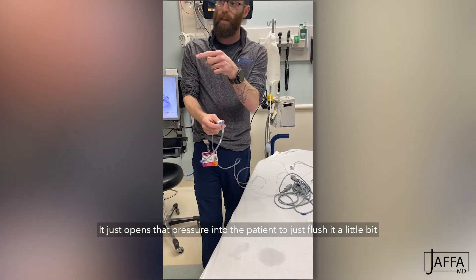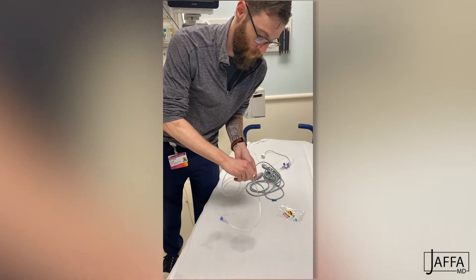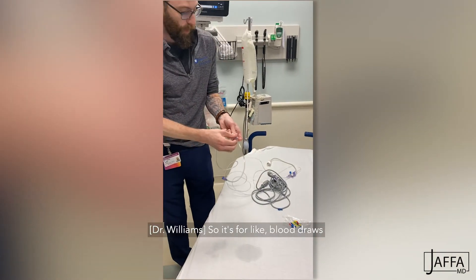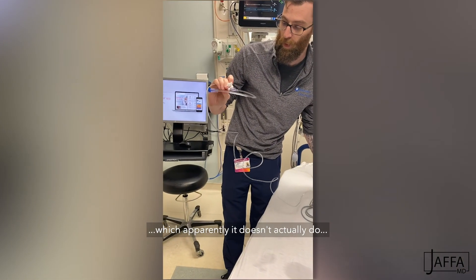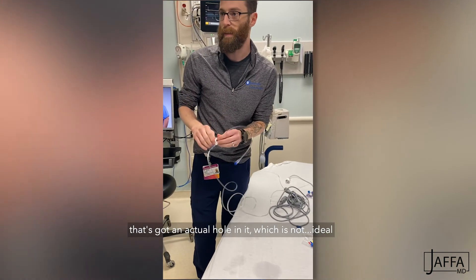Tell me again why we need to put this blue cap on there. Because they don't have holes in the middle of them — so if we switch this back out, whereas now you can just stick the needle in there for something like this, and then open this, this is going to potentially leak out. It's got an actual hole in it, which is not ideal.